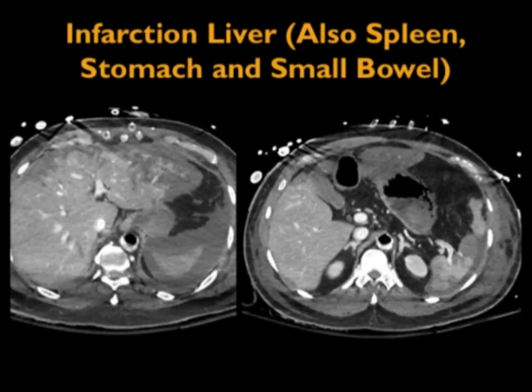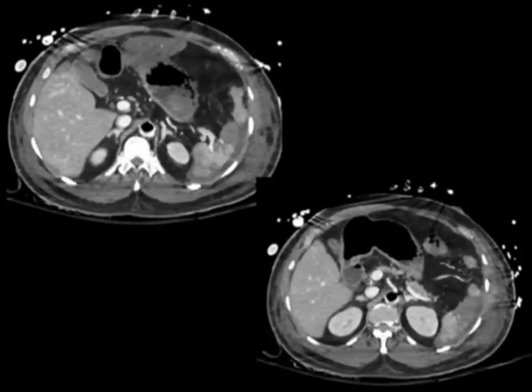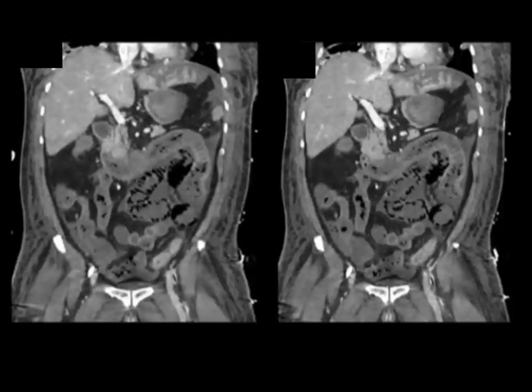Here's a great case — look at the liver, the spleen, the stomach where it has pneumatosis. This is a post-op patient who now has infarction of the liver. The most common causes for liver infarction might be related to surgery, such as pancreatic surgery. And here's another case with multiple infarcts present within both the spleen and the liver — septic emboli or some type of hypercoagulability state are the two most common causes.